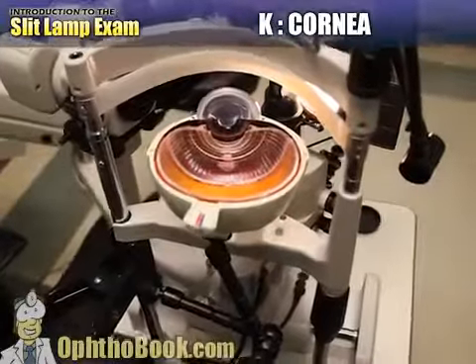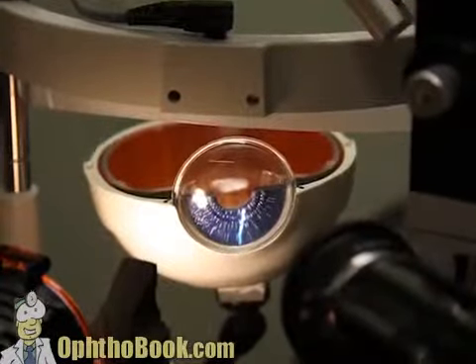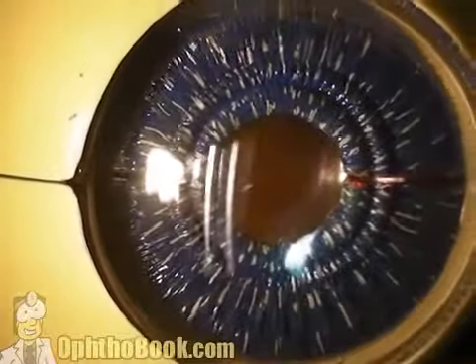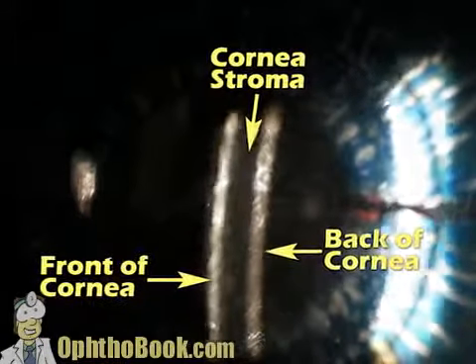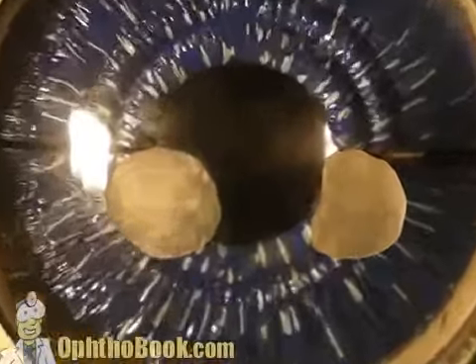Now the cornea is that clear window in the front part of the eye. We're going to switch to a different model to make it a little bit easier to see. And clear structures like the cornea really is where the slit lamp comes of age, because you can get a cross-sectional beam and look at that cornea in fine detail. And here you can see the beam is coming in from the left, and if you look closely, you can see the front of the cornea, you can look at the back of the cornea, you can look at the middle part of the cornea, and it's really nice to have that cross-section because it lets you track down lesions.